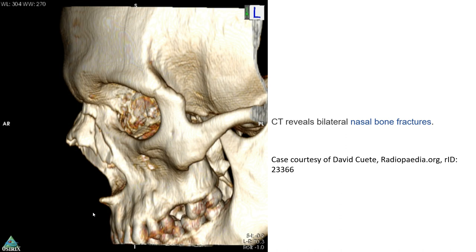This is a CT image of the nasal bone which has revealed bilateral nasal bone fracture, and you can see here.